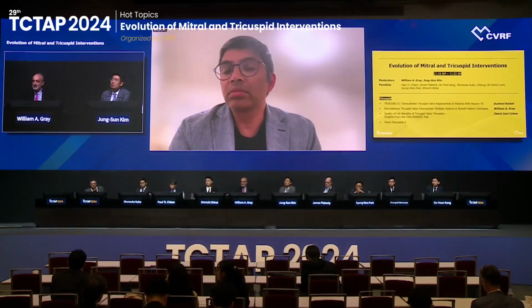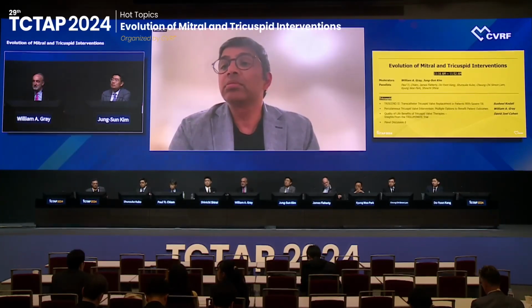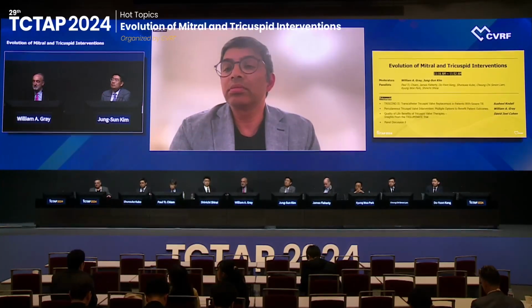Great, we have a question in the audience. Sir. I have a question for Dr. Kodali. Congratulations for your very successful TRISCEND 2 trial. But we all know that the right cardiac chambers are a low flow system. Do you have evidence of valve thrombosis? I noticed in your slides, if I correctly understood, you have 8% lung embolizations, pulmonary embolization.